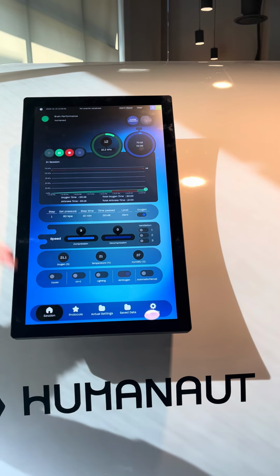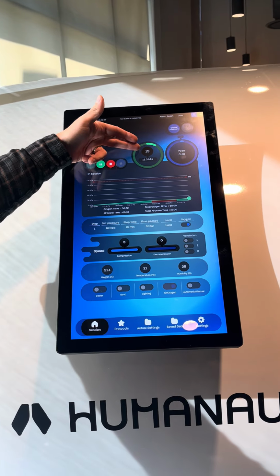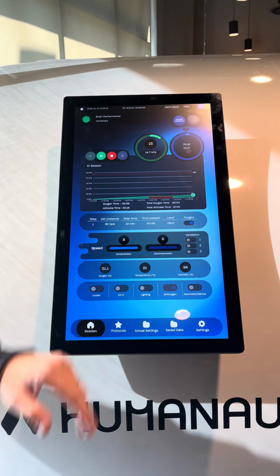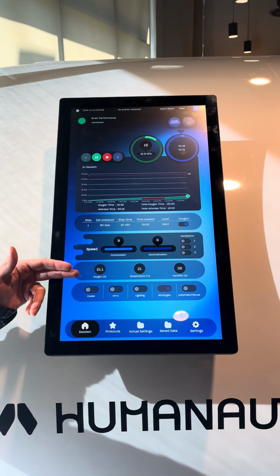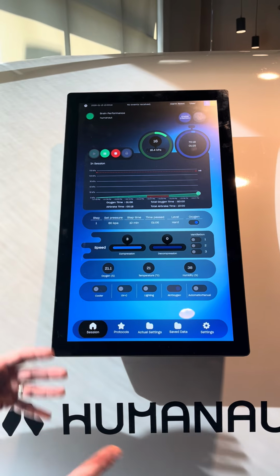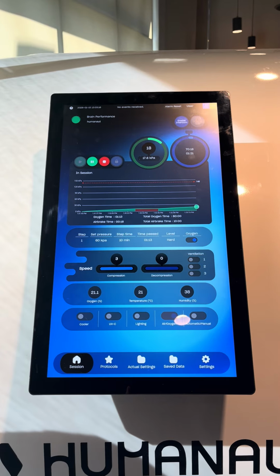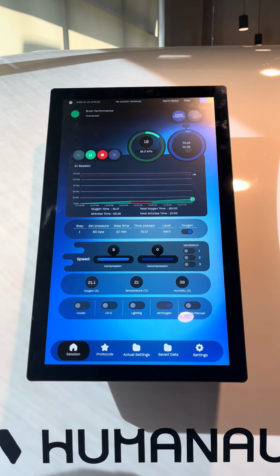And we can see our set pressure here, 60. This is gonna go to 60. It's gonna be 10 minutes. So it's gonna run that first step for 10 minutes on oxygen, okay? Give your oxygen percentage inside the chamber, monitoring that interior atmosphere for contamination, which the contamination point would be 23.5 in the US. It's different for every country.